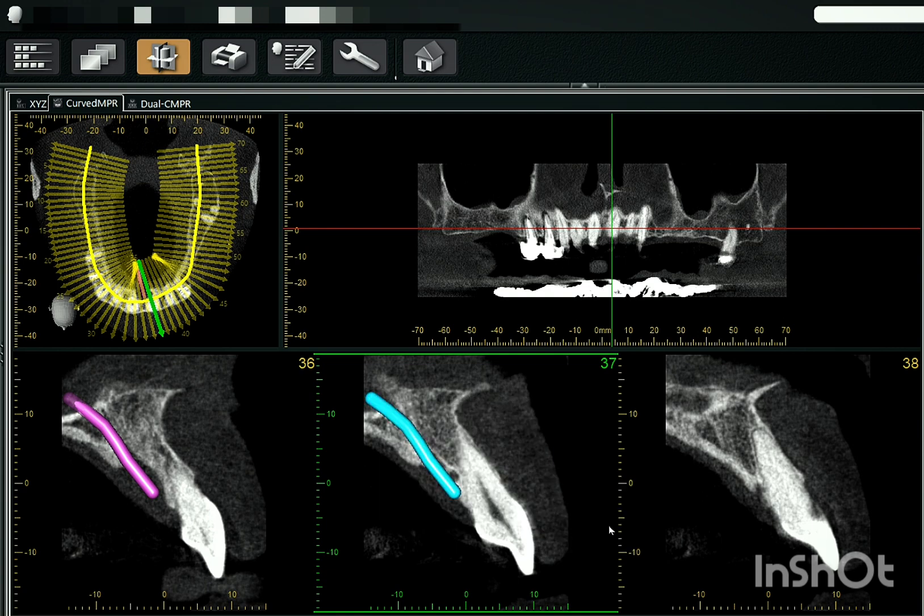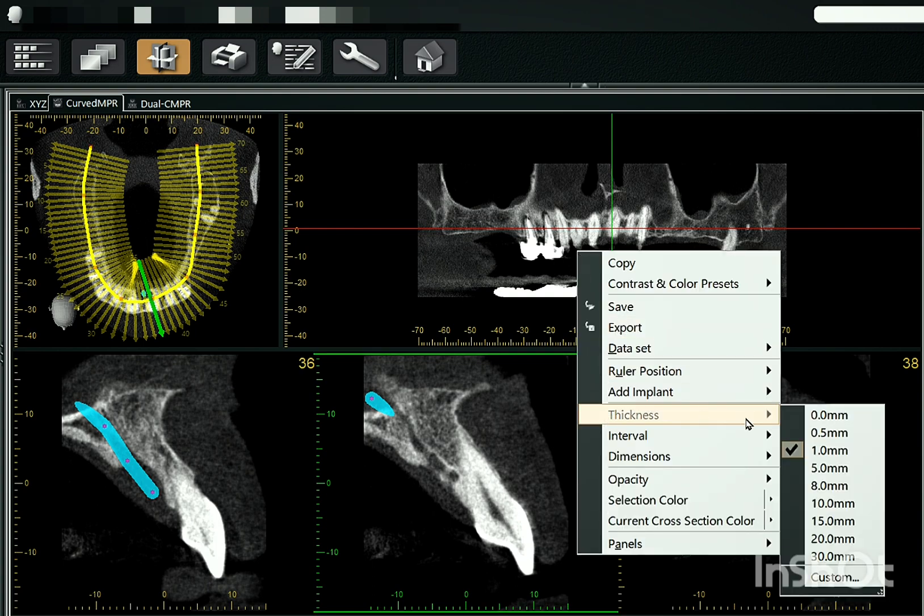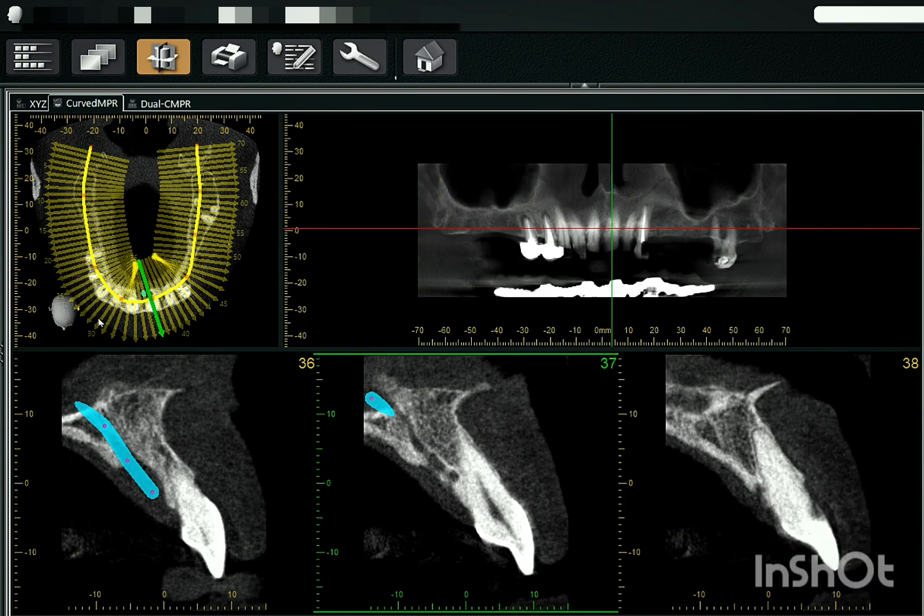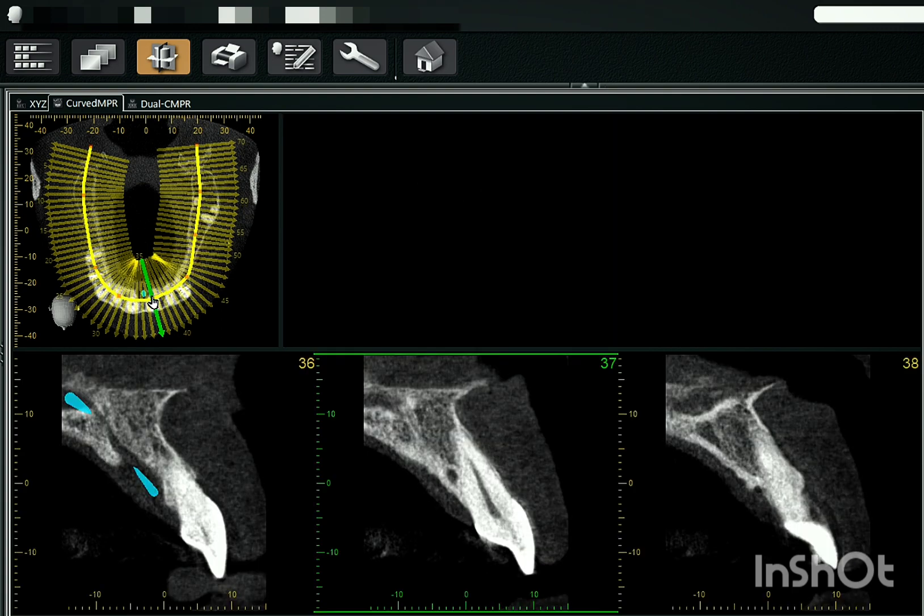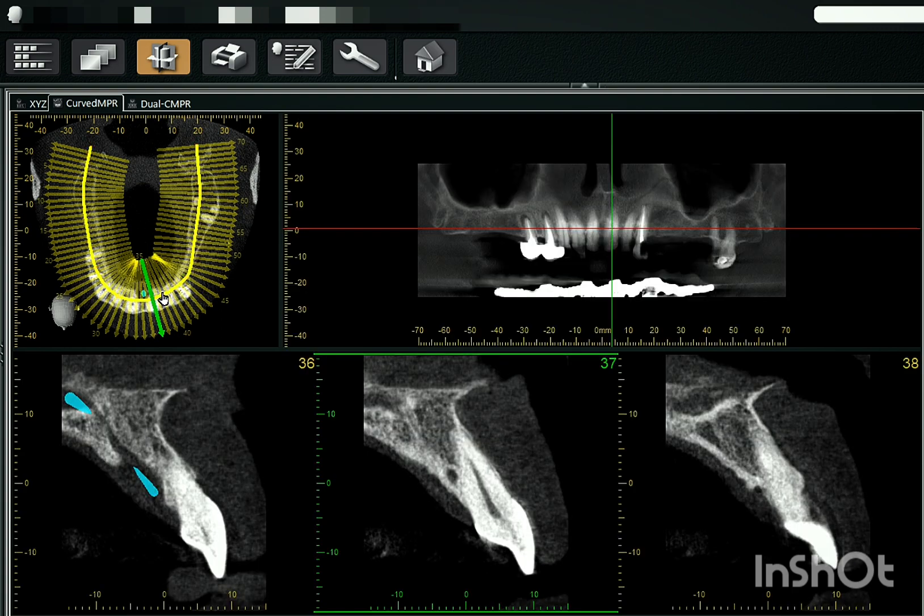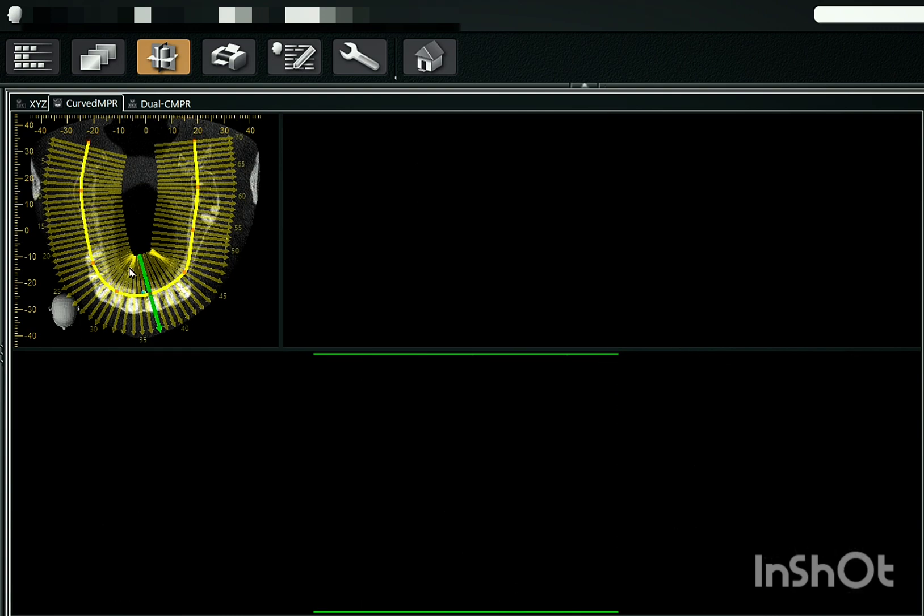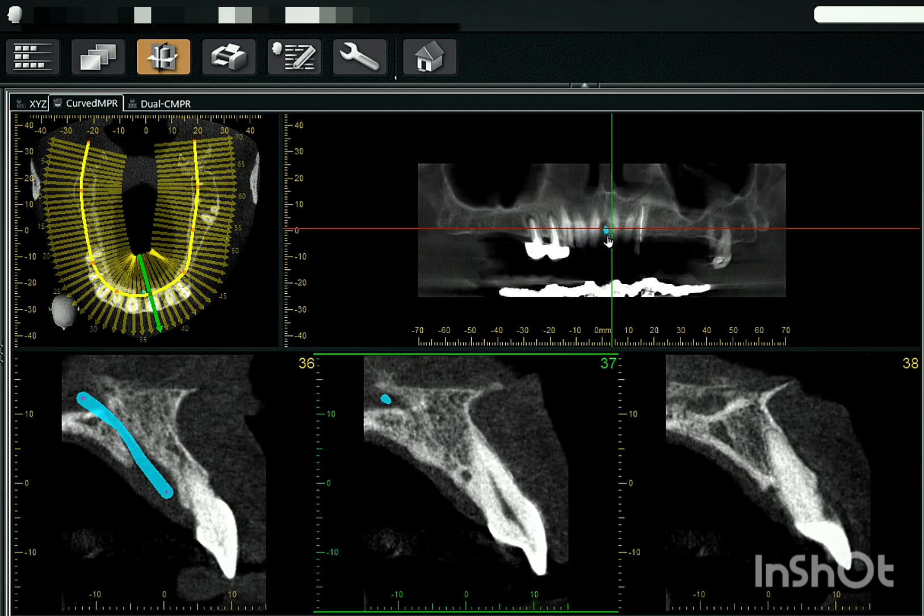So we'll mark it as blue color. This is 1 mm thickness, it is not clearly visible. So we'll just increase the thickness to 8 mm. So if you want the visibility of the nerve canal, just get this line towards the nerve canal in the CMPR axial.